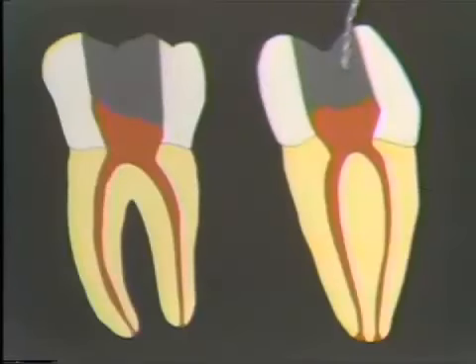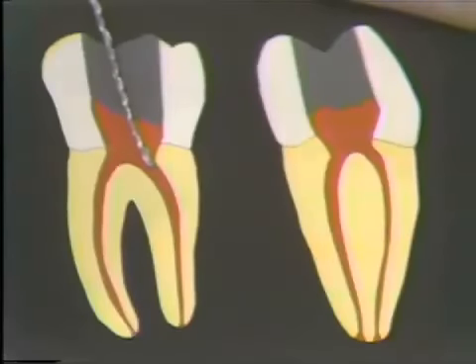Coming into the mesial lingual canal, you don't have to come all the way from the distal buccal because the canal is almost in the mesial of the tooth. You can come pretty much straight on down and you'll get right into that mesial lingual canal. To get into the distal canal, you come in from the mesial and you'll slide right on down into that big canal. And you want to make sure to check for two canals in that distal.